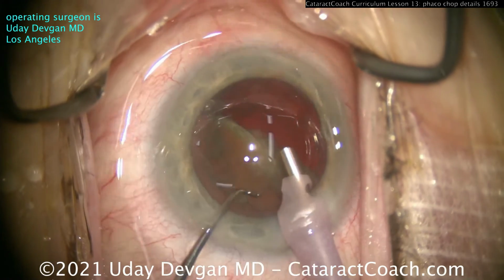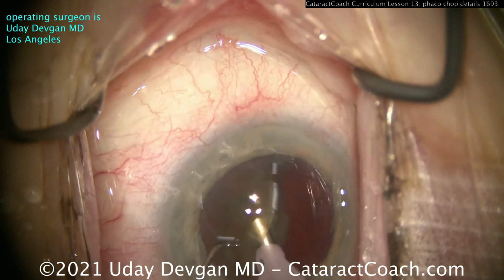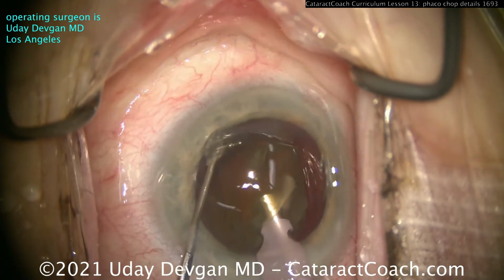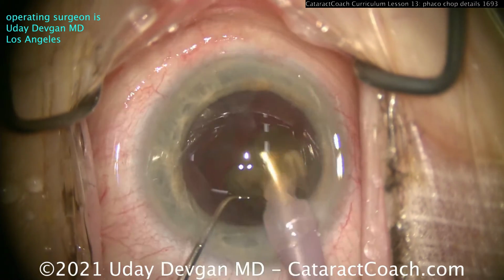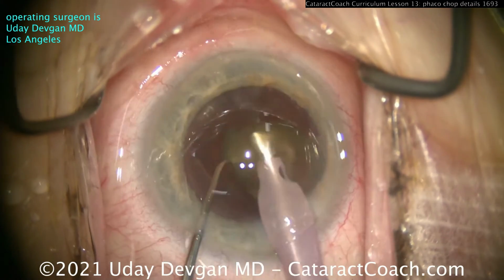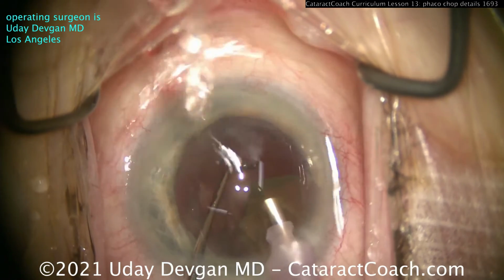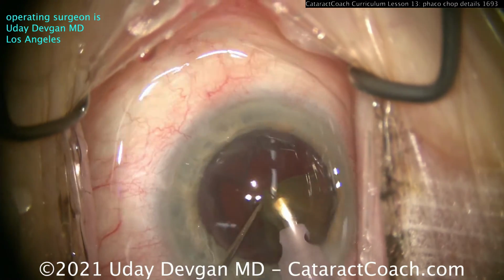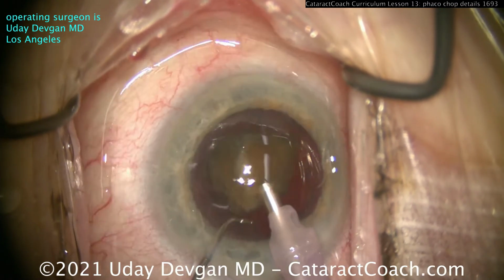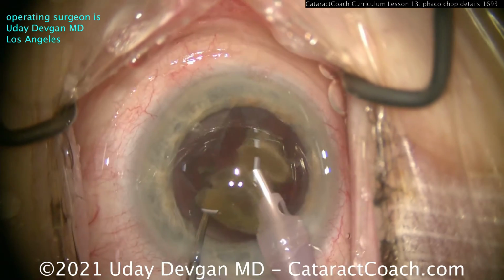So now here comes the second half. Let's rotate that around, use the chopper, get into a more advantageous position, buzz in, and notice we don't buzz in the center, we buzz in the side of it just to break off a small little quadrant. Or even smaller than a quadrant. So when that small piece is broken off, it can be emulsified down, and then that last piece is going to follow pretty easily. You can either just wolf it down or chop it further. Here's yet another chop just to make you guys happy. So again, a smaller piece is a lot easier to aspirate here.